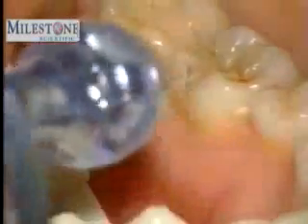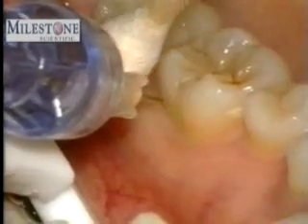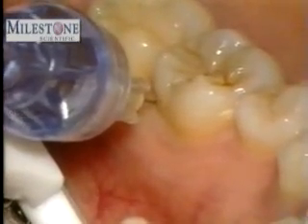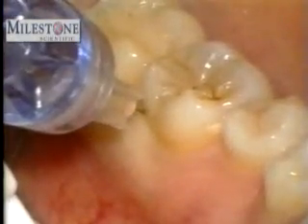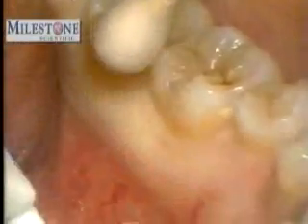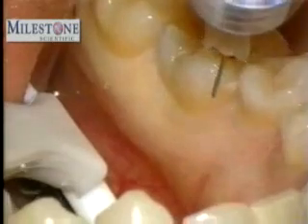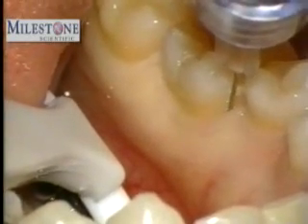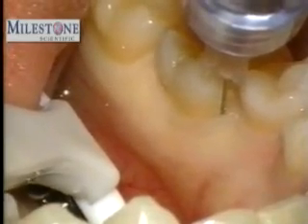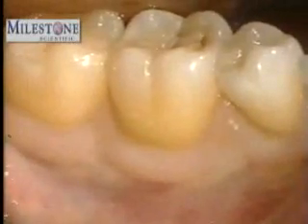The PDL injection is initiated with the slow flow rate and a very slow needle penetration. Maintain firm pressure on the handpiece to ensure that no leakage of fluid exits from the gingival sulcus. Watch for tissue blanching, which should encompass the tooth circumferentially and extend to the mucogingival junction, mesial and distal, to the tooth being anesthetized. Blanching must be evident on the buccal as well as the lingual soft tissues.